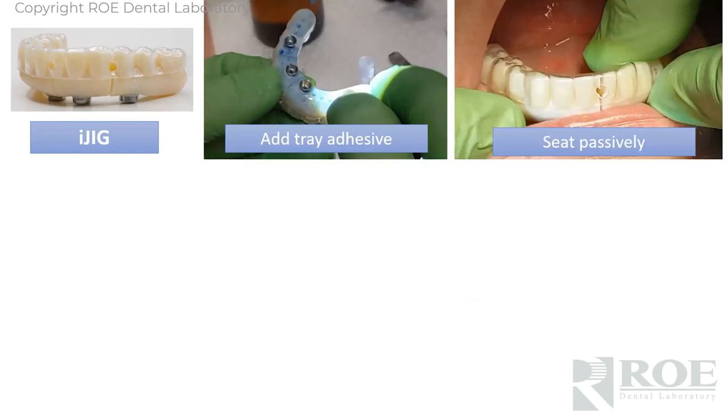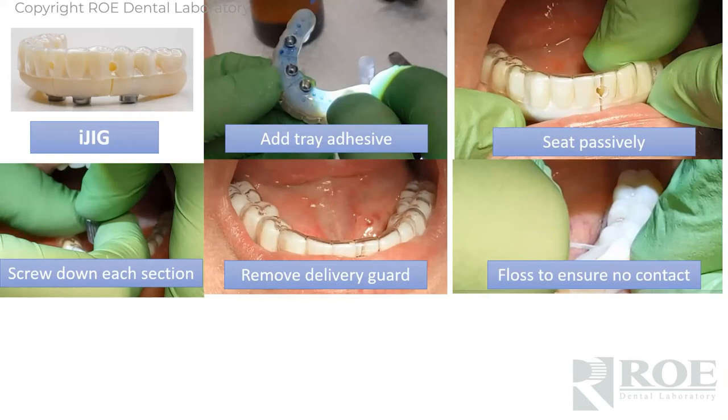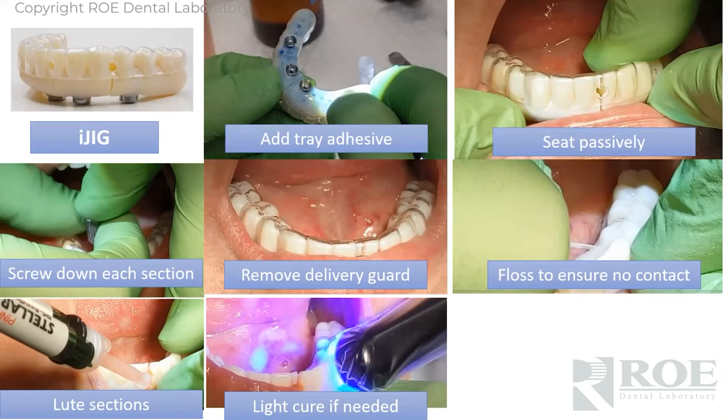We will fabricate this. The neat thing about this is it's sectioned — because we don't have an analog model to put copings in. What you'll do is simply seat this in the mouth, make sure those sections are passive and there's some passivity between them. You can put some dental floss through them. Then do an injection procedure to lute them all together, using Stellar, Voco, or Duralay — a near-zero shrinkage factor is very important. Then cure it.